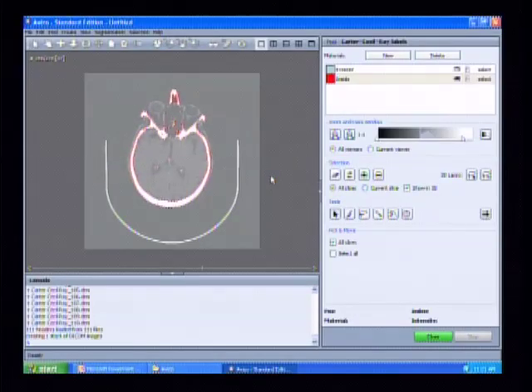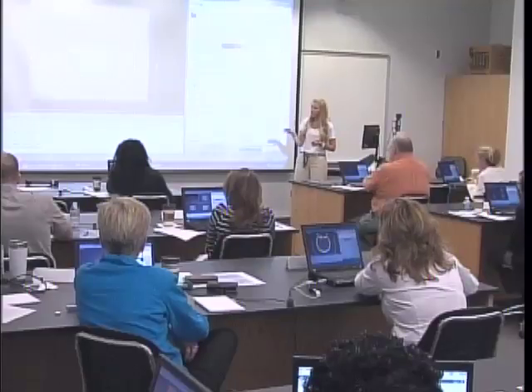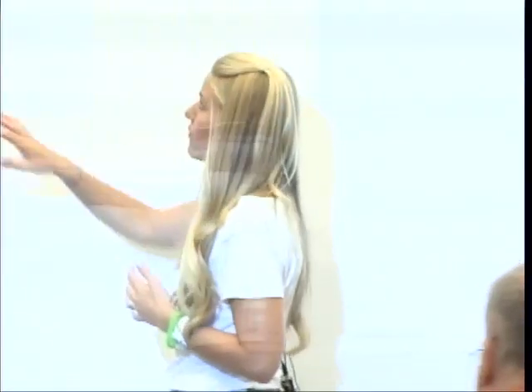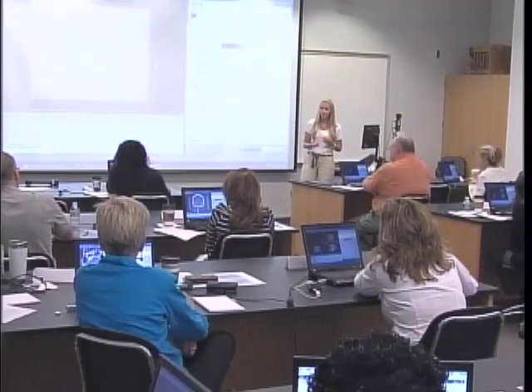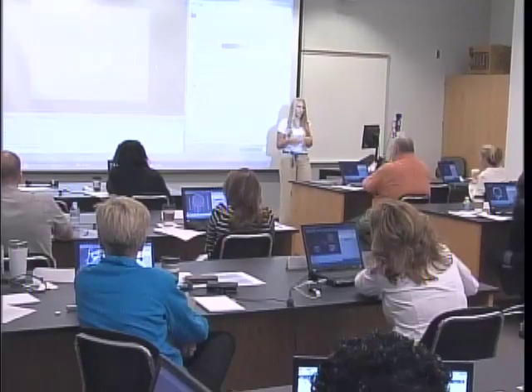So what I think we're going to do is I'm going to let you guys go for a second and try to scroll through these, and I'm going to walk around and try to help you. What we want you to do in any of these 3 views is find a slice, like this one, where you have these little artifacts that aren't part of our segmentation. You want to go through and remove those. Continue to find things like that and remove them until all we're left with is the basic cranium. And one of the main problems we're going to face, and what's probably going to take us the longest, is trying to remove the vertebral bodies from this scan.